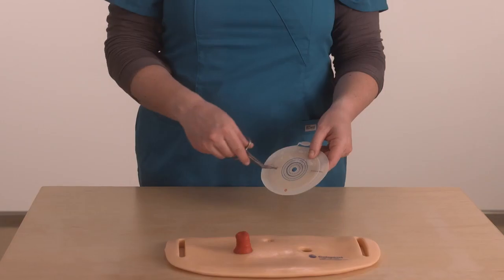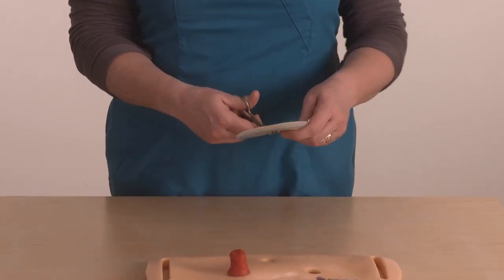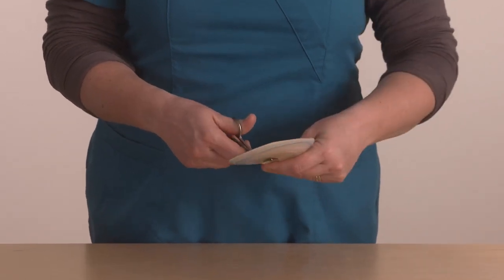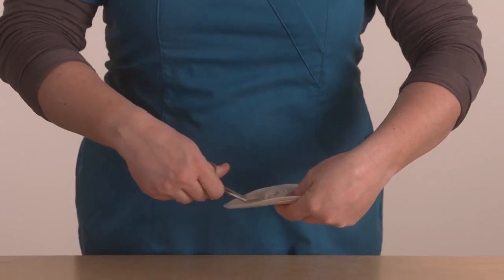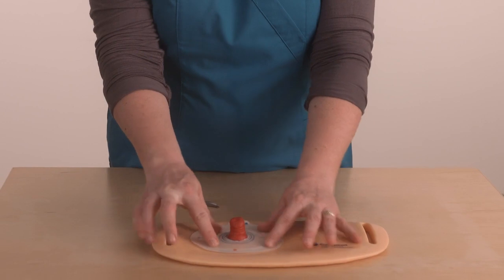stomas. A cut-to-fit barrier is cut to the size of the stoma before applying it using a pair of ostomy scissors. It is important to cut the hole so that it will have a snug fit around the stoma, going over the stoma easily, but not leaving any exposed skin around the stoma.